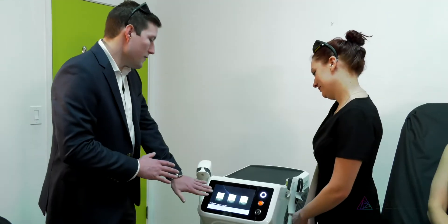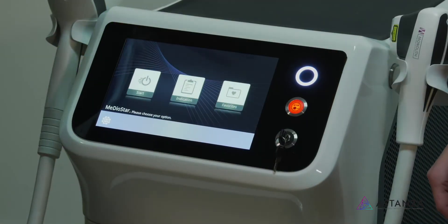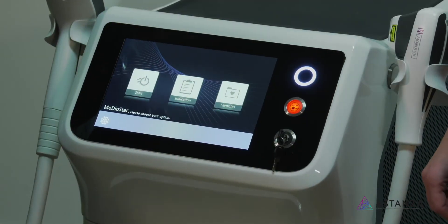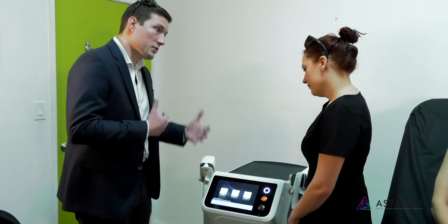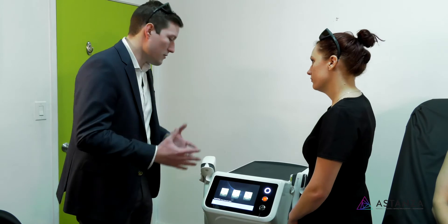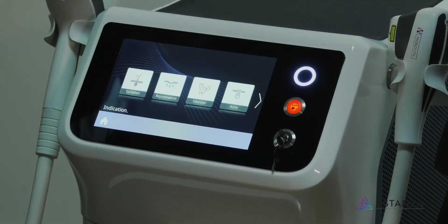Hi, I'm Josh with Astanza Laser. I'm a biomedical engineer here by schooling and by training. I've been here for about five years and I'm here to run through how to use the Mediostar Monolith. You're going to have your three beginning buttons on the opening screen. The first is the start button — it goes to whatever setting we were using last and starts it up. I like to use the indications features especially when treating multiple areas, different patients, and different skin tones, so I can jump right into what I'm looking for.